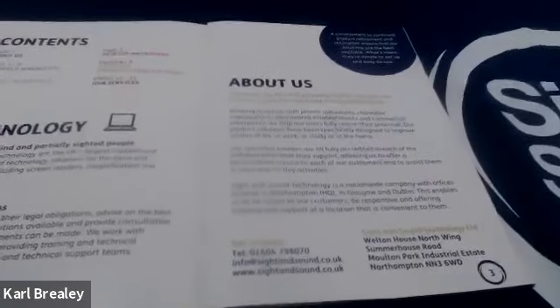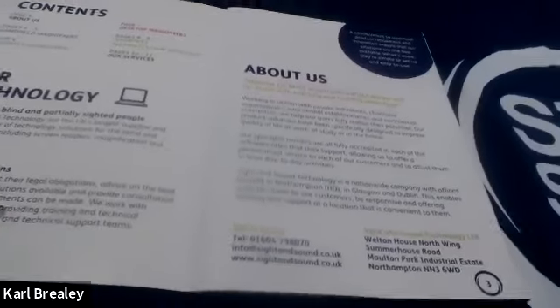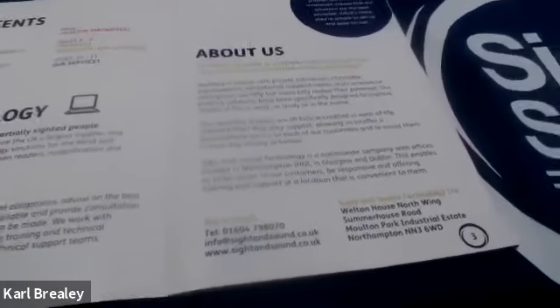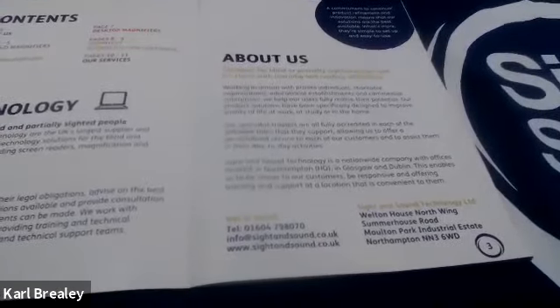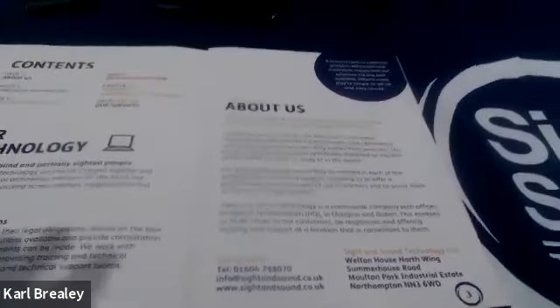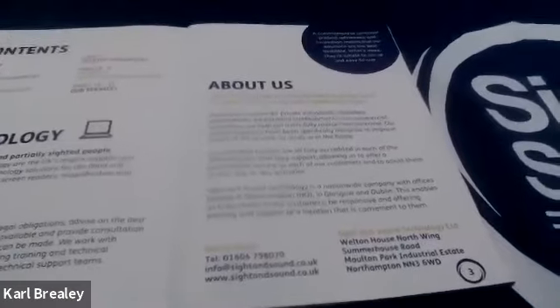Oh, Anthony's just put something on. I forgot about that from using the app. There is an app that can be downloaded for the iPhone and iOS where they have actually put my Find Device button on there, which will use the Bluetooth within the device. I did forget about that. But yeah, there you go, you see. I knew it was a good idea to have Anthony here.